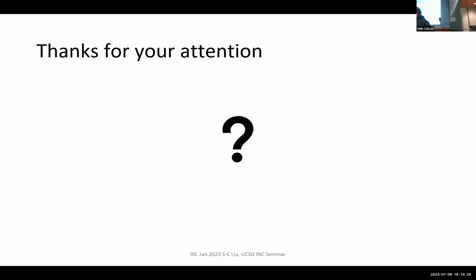In the final video that you showed, people playing Pong. So was that a person who could see before, or the product of training for people who couldn't see? No. That one was just that you put the VR display on them and then you show them this very coarse phosphene output, and you ask them to play the Pong game. They didn't get trained for it. But the fact that the ball was moving, they could get an idea of where the ball is and moved the mouse. Normal people, but we put the VR display on them, so what they're seeing is just the phosphene map that I showed. Just like the video we see. Yes, exactly. It's definitely much better than what the real patients would see.